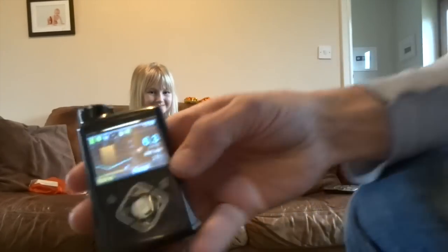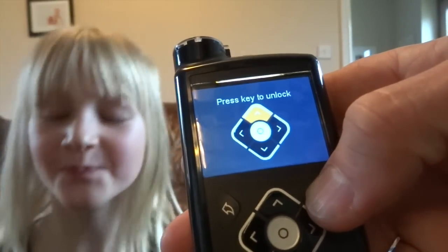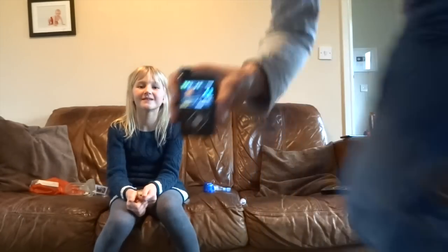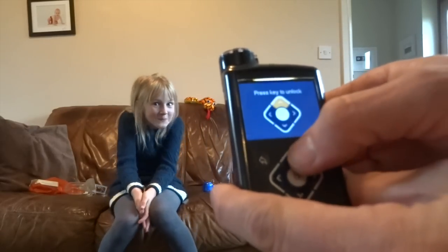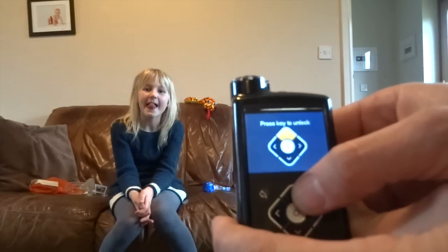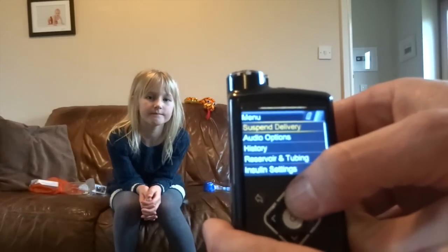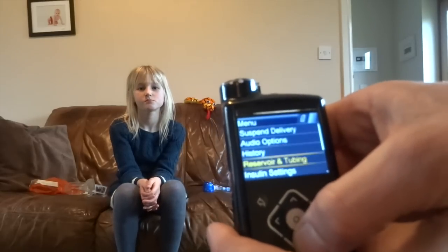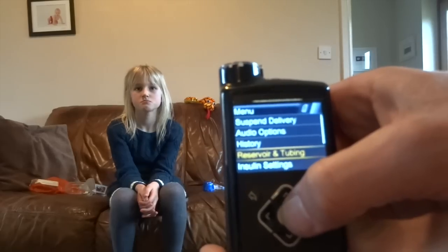Now we have to go through the menus. I'll come a little bit closer because this is the first time — we'll look at it on the screen. So we go across to the menu. That's the key to unlock. This is the first time I've done a set change on this pump, so we'll give it a go. We've got an unlock — you have to press the top arrow to unlock it, and that changes every time so you can't just guess. It will be down in Reservoir and Tubing — used to be called Reservoir and Set, it's now Reservoir and Tubing, which is more descriptive.